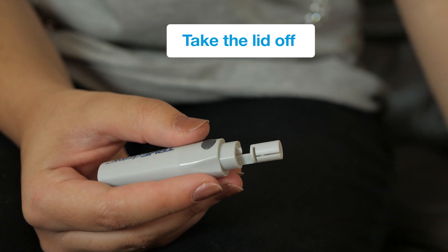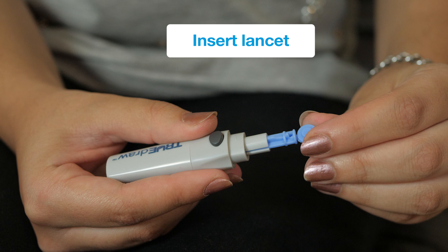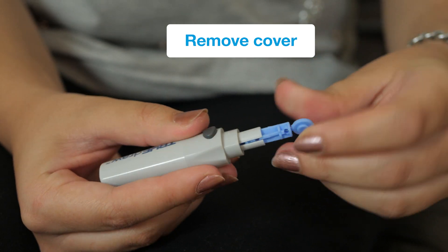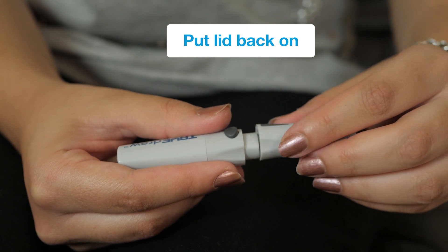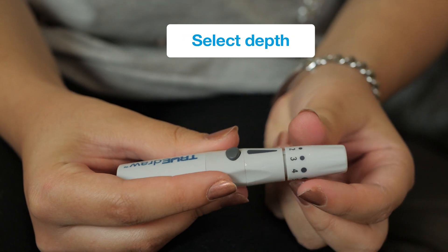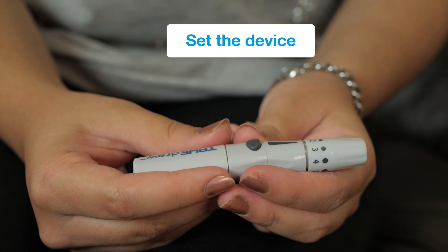Take the lid off your lancing device, take your lancet and slot it in, remove the protective cover, then pop the lid back on. You can select the depth of the puncture and finally set the device by pulling the plunger.